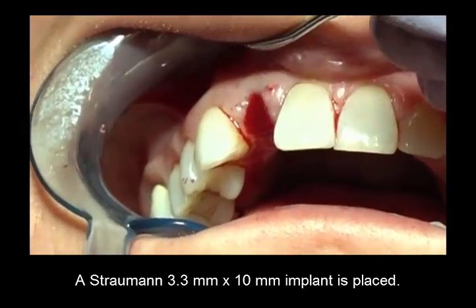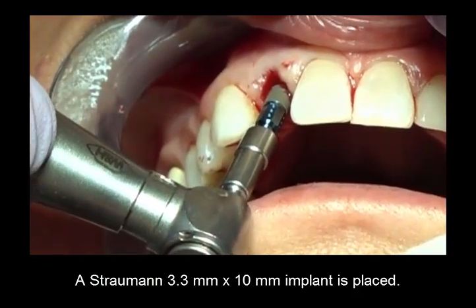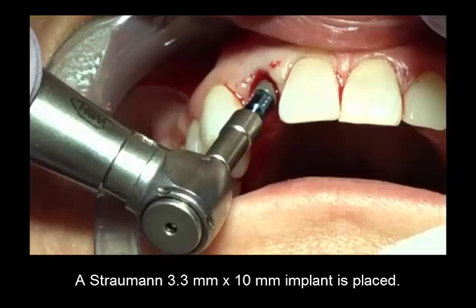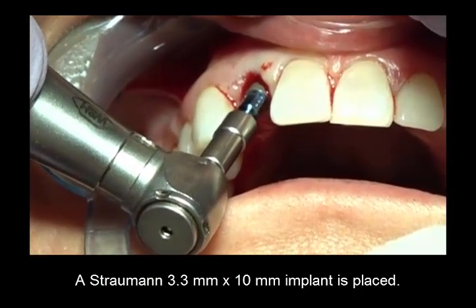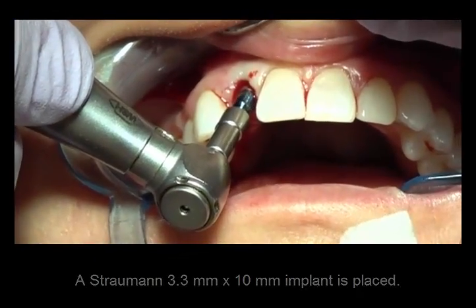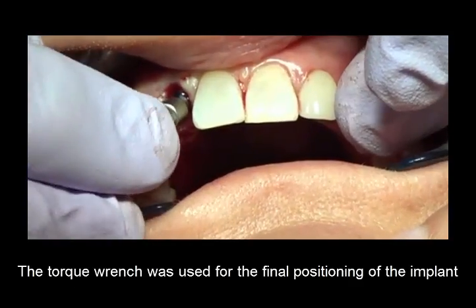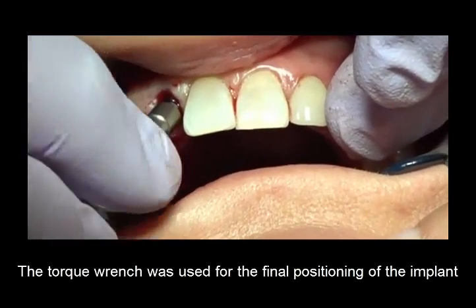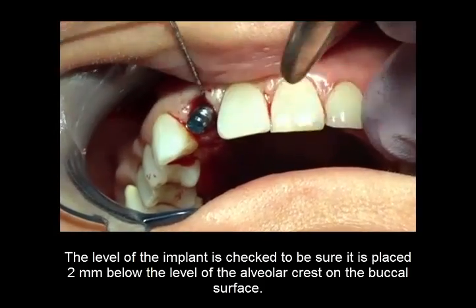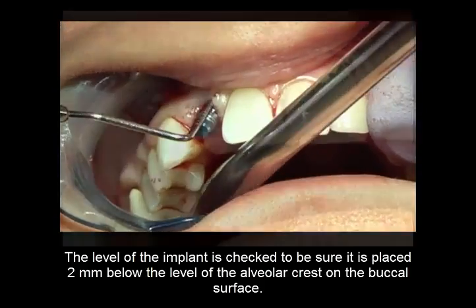A tapered Straumann 3.3 by 10 millimeter bone level implant is placed, allowing the implant to follow the axis of the osteotomy. A torque wrench was used for the final placement of the implant. The level of the implant is checked with a periodontal probe to be sure it was placed 2 millimeters below the level of the alveolar crest on the buccal surface.